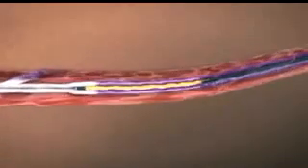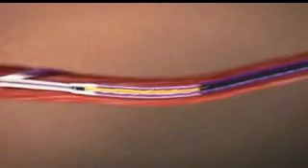Thorough tumescent infiltration and external compression assure good contact between the catheter and the vein wall.